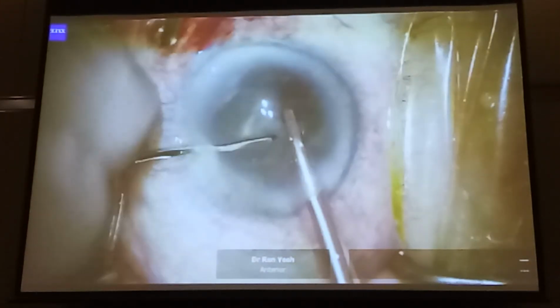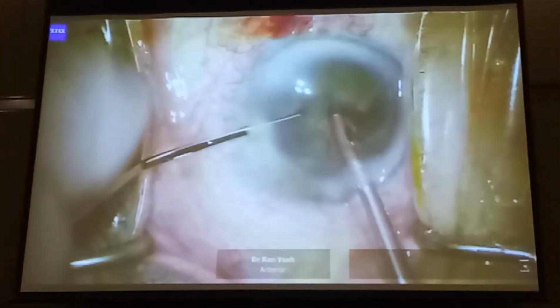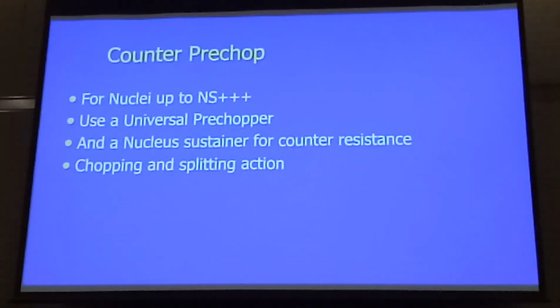So I think that the pre-chop can help in that small pupil. It can also help get you out of trouble in some of these in which there's a partially cracked, softish nucleus. So I think I'll just stop pre-chop here. I think the counter pre-chop is a little bit too complex. We'll leave that for another day.